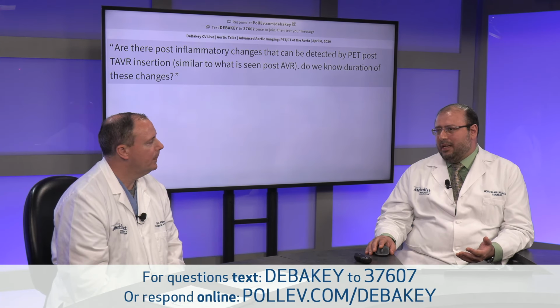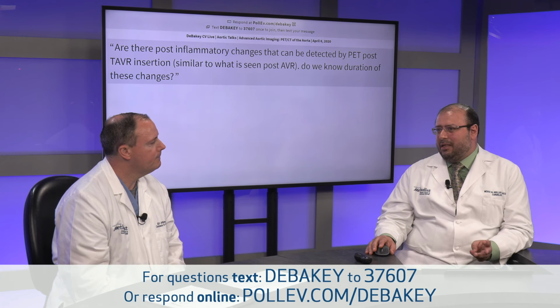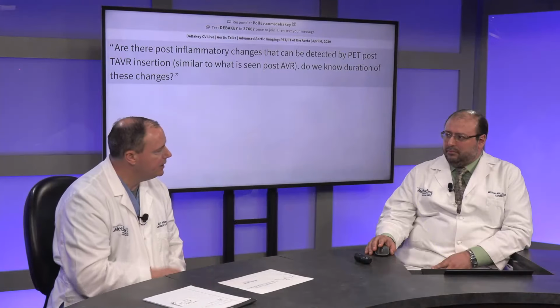But I would think that there are areas, as I said, where renal failure and devices are probably better served by PET, because these patients will obviously not get gadolinium for viability if they have a low GFR, or if the device's image quality may be a little bit lower than the usual image quality we get with the typical nice cardiac MRI in our lab here. Are there times when PET-CT would also have limitations, or patients you would not want to use it in?